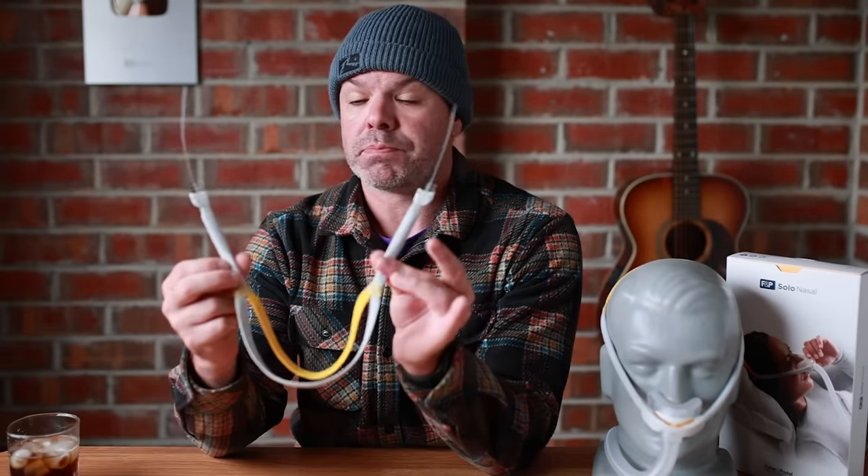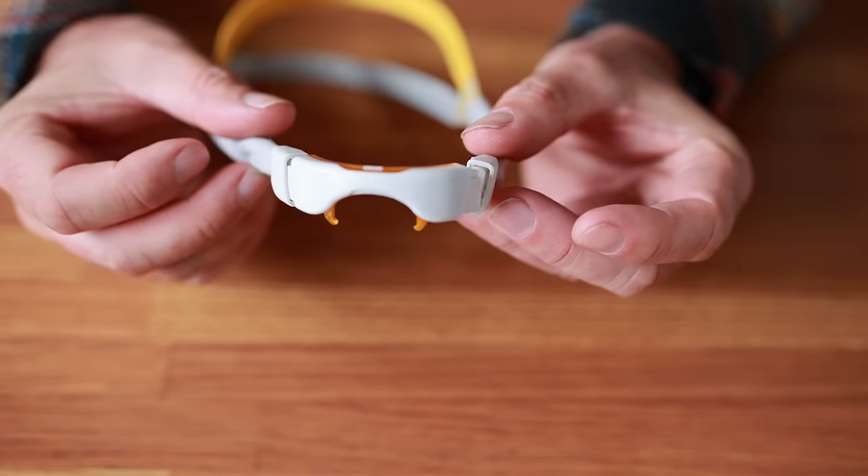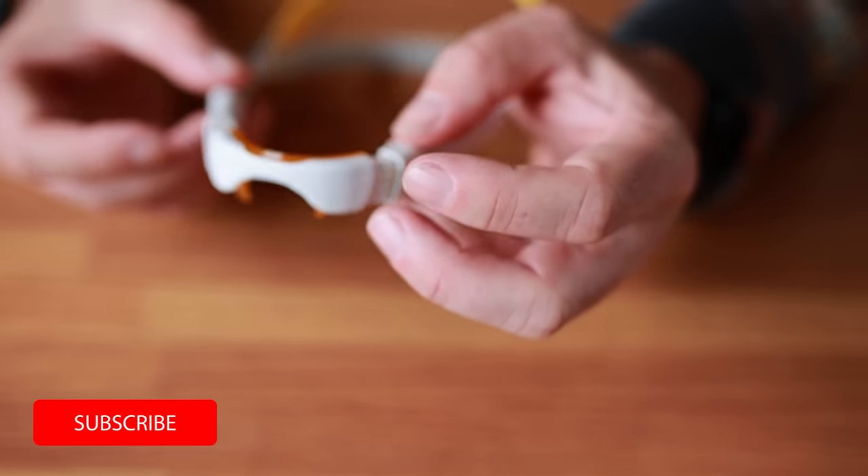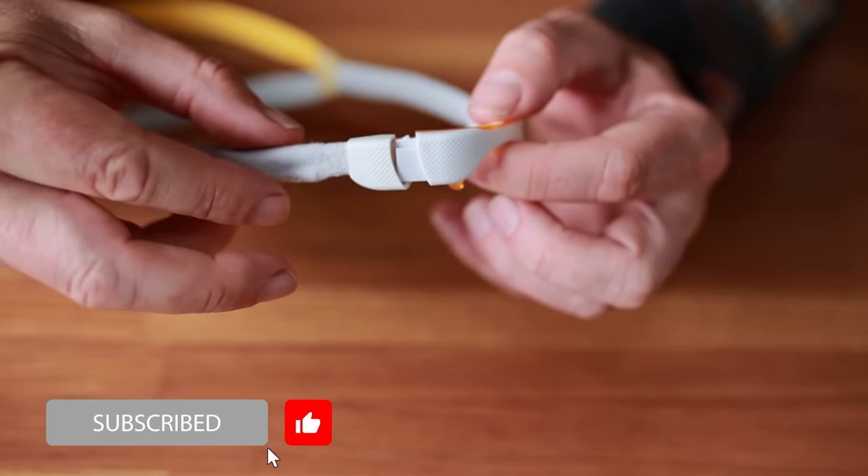All right, let's take a closer look at this brand new headgear because it's pure magic. Let's take it apart and I'll try and explain exactly what's going on and how it works. Here we go.